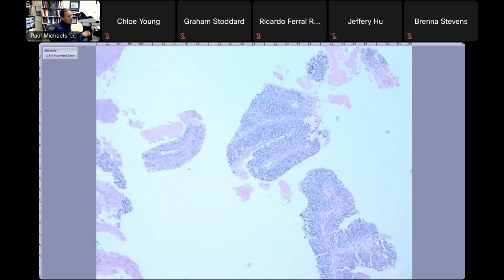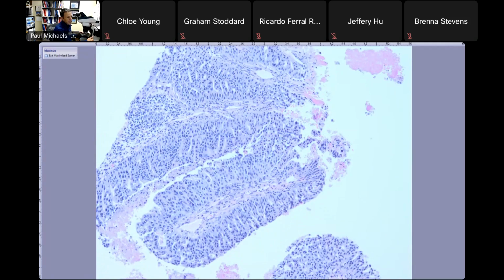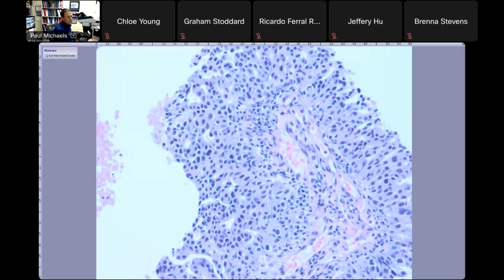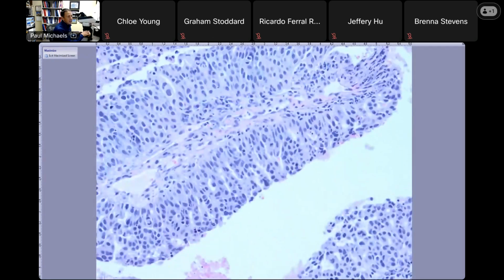But this doesn't look anything like an adrenal cortical adenoma. It's also pretty big. They can definitely be that size. When they get up to around 8 centimeters, you think about adrenal cortical carcinoma. This could be an adrenal cortical carcinoma, I guess, but I don't think so. You usually don't have this kind of what looks like a glandular or micropapillary architecture.